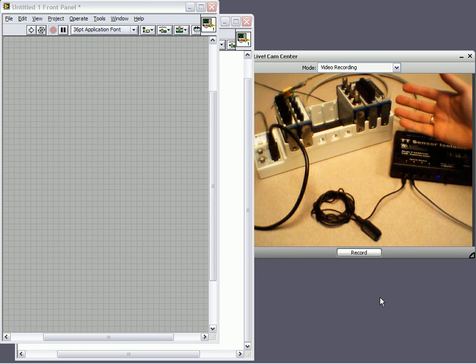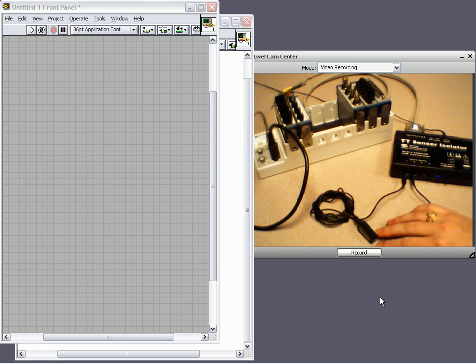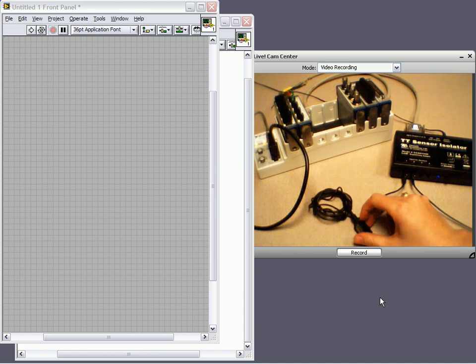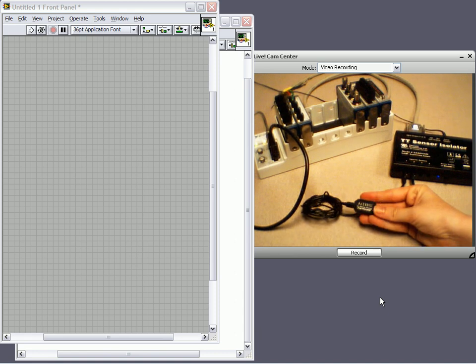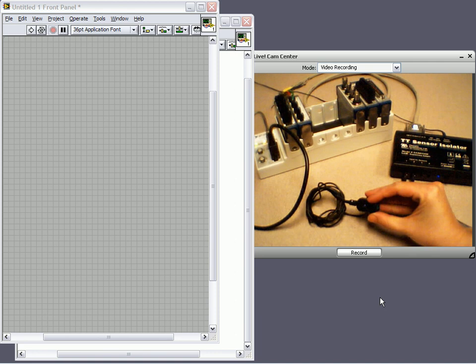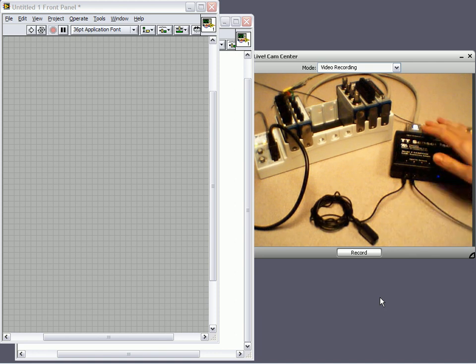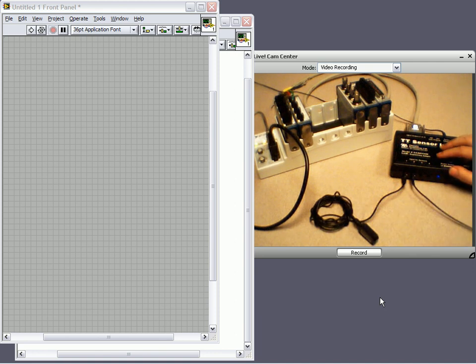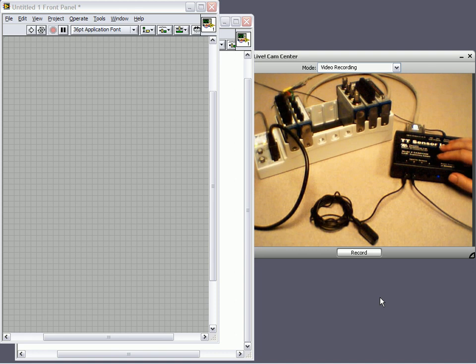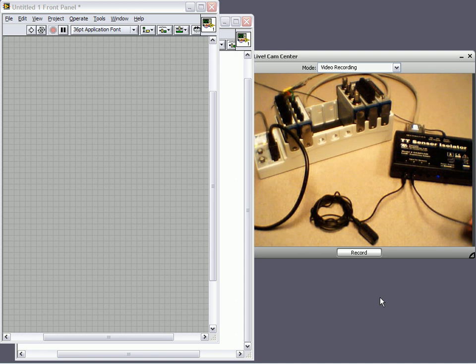Now in the previous video I showed you how to connect your sensors, in this case a heart rate or blood volume pulse sensor, to the isolation provided by the Thought Technology Sensor Isolator. You'll notice that the respiration belt is no longer in the screen, it's currently about my abdomen.